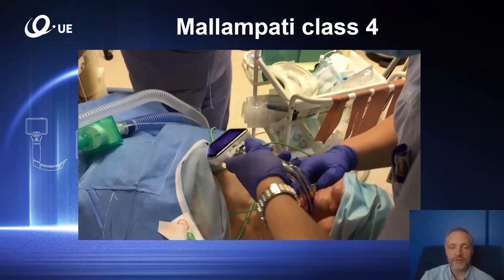And not only obese patients can have some possible difficult intubation, also patients with Mallampati class 4. Here you have the patient with this Mallampati class 4. As you can see, when this patient was intubated, the display was not ideal, but still was enough to intubate this patient very smoothly. I'm sure and absolutely convinced that if we tried to intubate this patient with the standard Macintosh blade laryngoscope, there would be some severe problems with intubation.